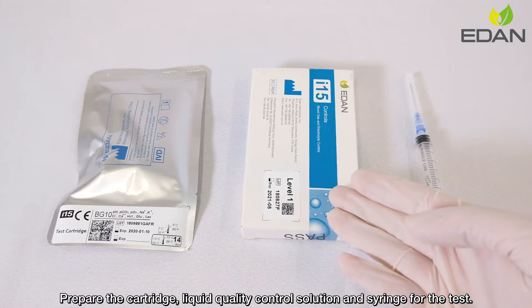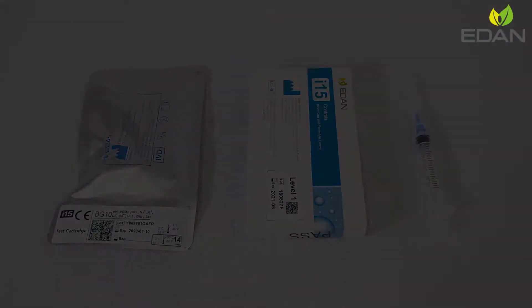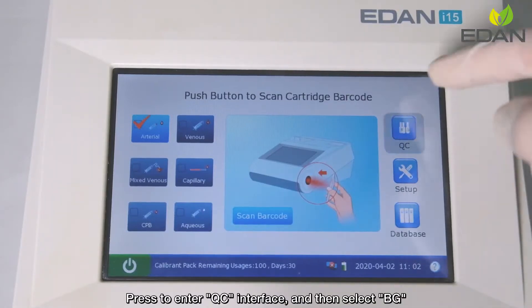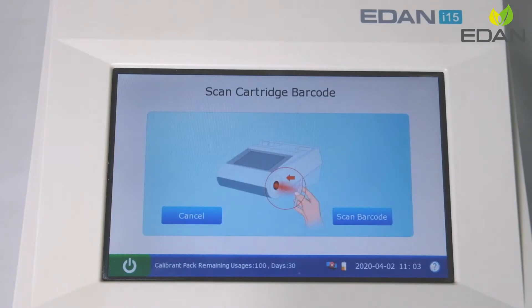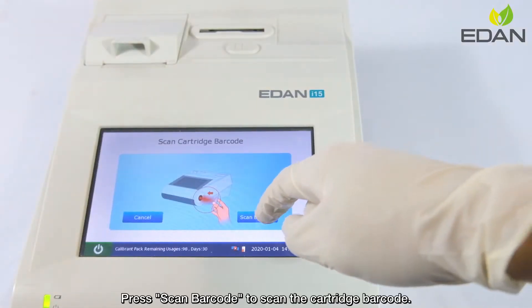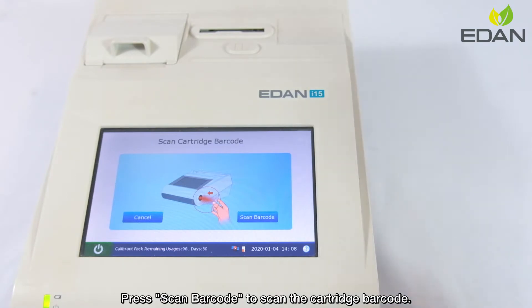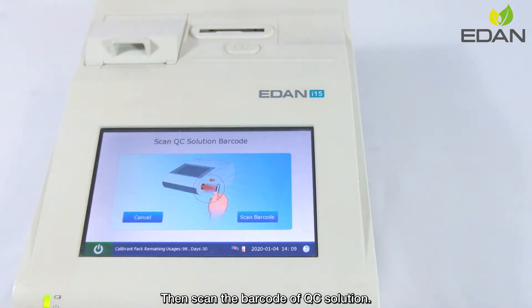Prepare the cartridge, liquid quality control solution, and syringe for the test. Press to enter QC interface and then select BG. Press scan barcode to scan the cartridge barcode, then scan the barcode of QC solution.